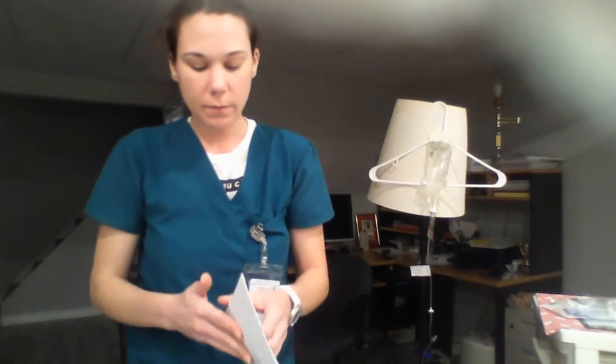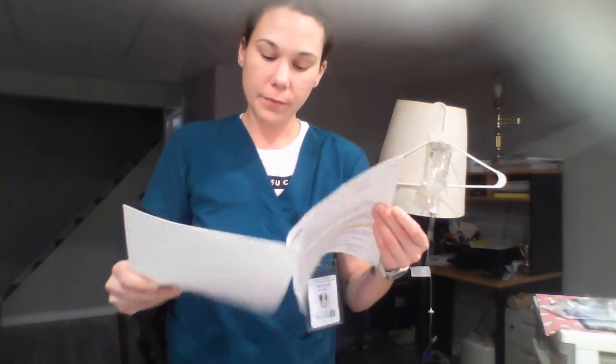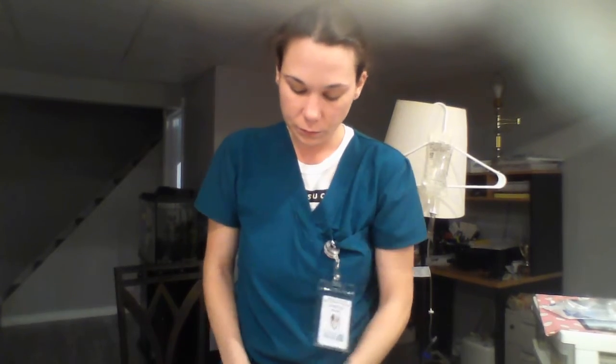So I'm going to go right into my policies. And before I give this medication, I want to ensure that I have the knowledge, skill, and judgment to proceed with this administration. And I also want to check the compatibility of all IV medications with other medications and fluids running through the line. It must be assessed and confirmed prior to commencing administration. I'm going to open my client's chart just to collect some relevant information.